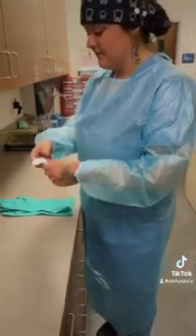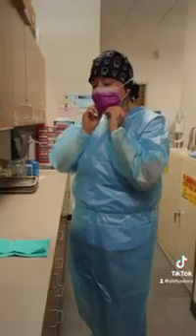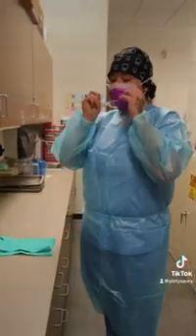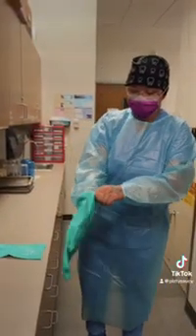After our gown is on, we're going to first put on our mask, and then our eyewear, and then last our utility gloves.